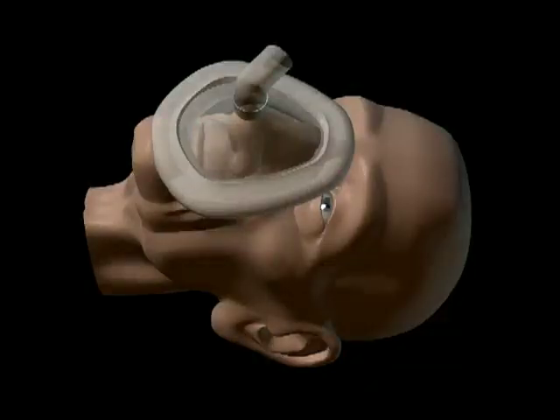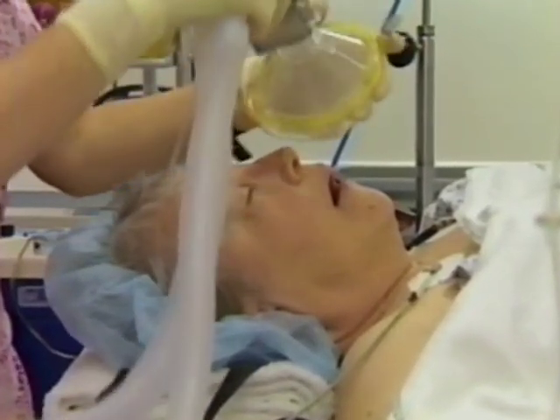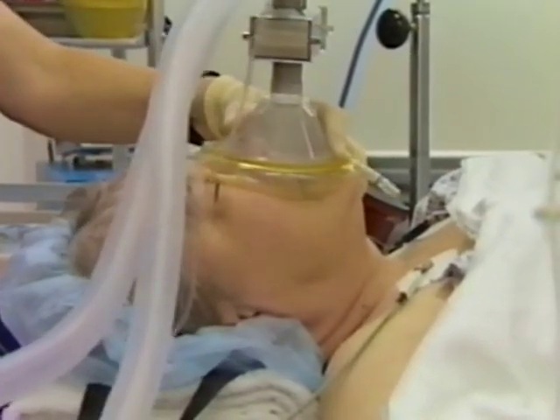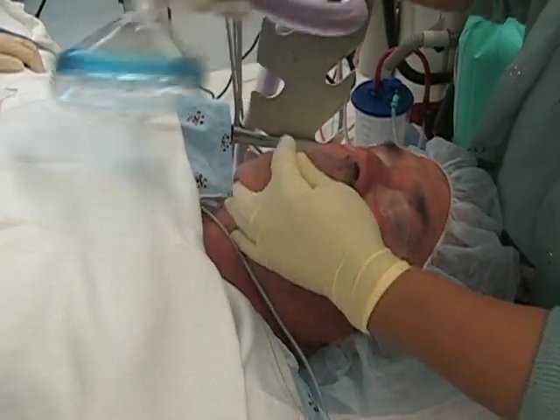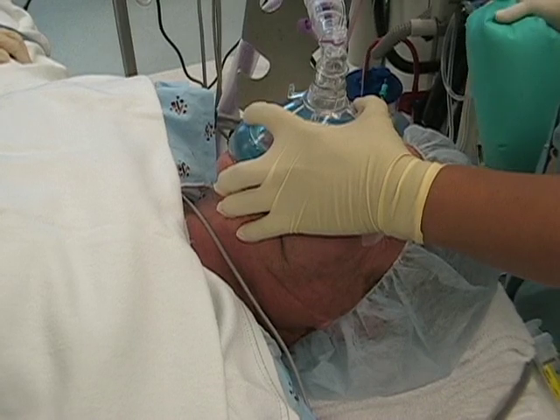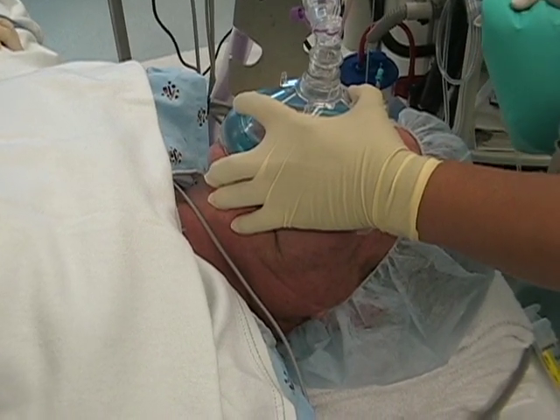Some patients are more difficult to ventilate than others. In edentulous patients, the lack of teeth allows the cheek tissue to sag unsupported, leaving large gaps around the mask. In the obese patient, an extensive double chin and full cheeks can make it hard to grip both the mask and the face effectively. Airway obstruction from pharyngeal soft tissue is common. In addition, the weight of the patient's chest may force you to use higher inflation pressures, which can distend the stomach.